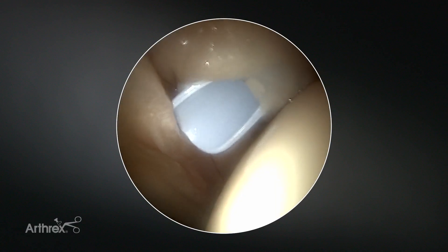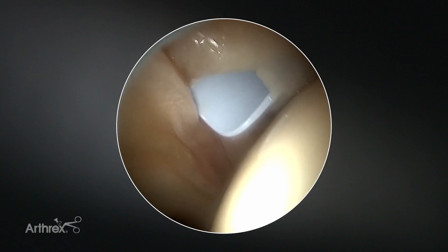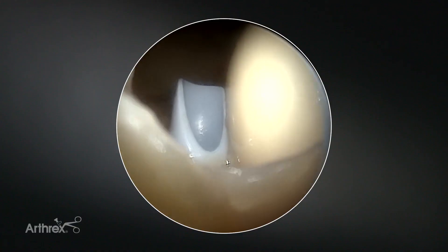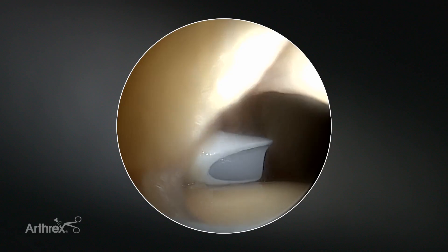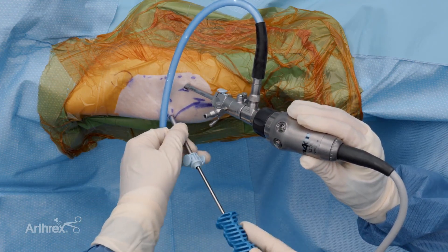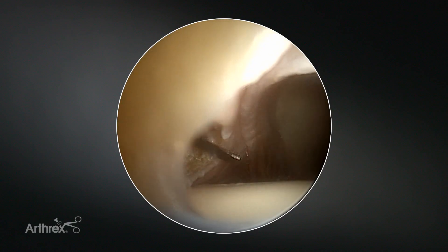The cannula is resting on the labrum, and a key safety feature is that the camera lens will not protrude longer than the flush fit cannula. We now know our safe steps to switch the camera from the anterolateral to the mid-anterior position — find the chin-up bar position on the T-piece and click into position. Using the oblique view back at the original flush fit cannula, there is no scalloping of the articular cartilage with the flush fit cannula. We back the cannula up and begin the second periportal capsulotomy, coming down the anterolateral portal into the hip. Even in pediatric cases — in this specimen, less than a hundred pound total body weight — there is enough room for instrumentation.